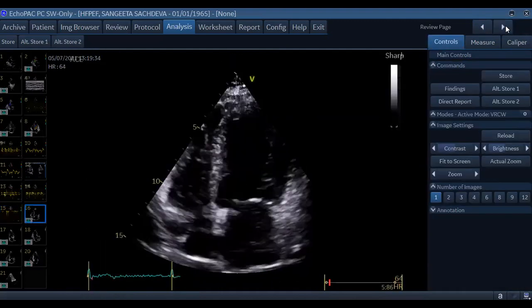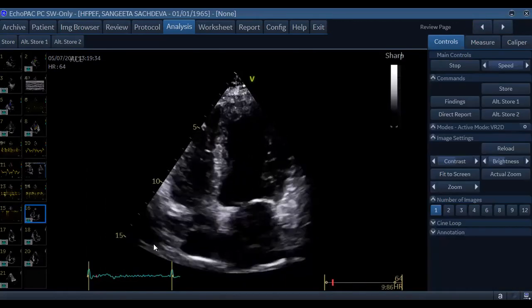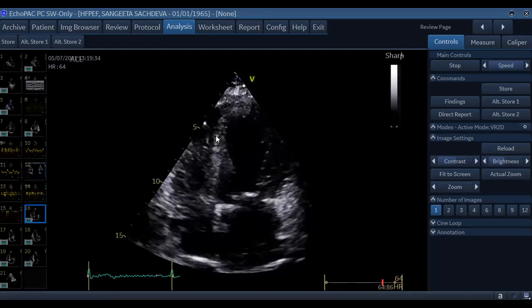No, what I was trying to say is just put an M-mode like this. It will give you the TAPSE. Right? Okay, got it, sir. Anything else, Dinesh? No, sir. Thanks. All right, thank you.